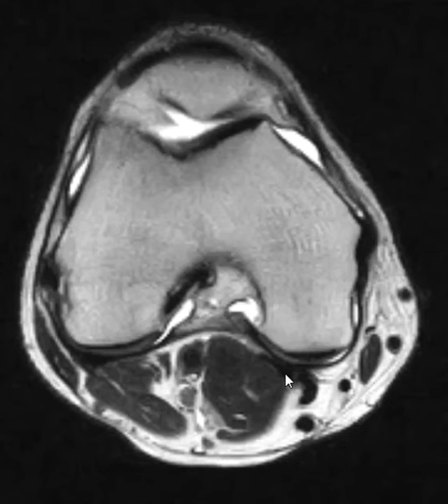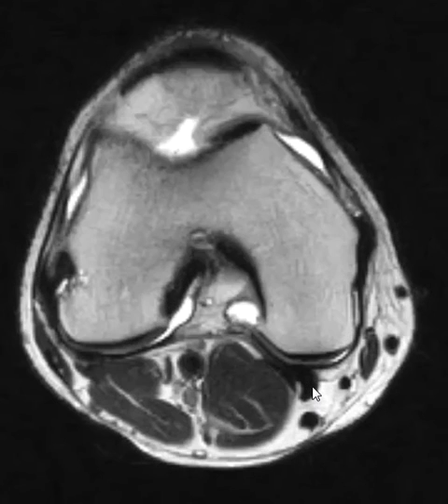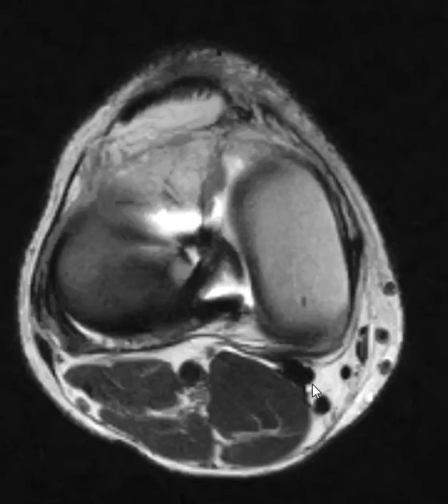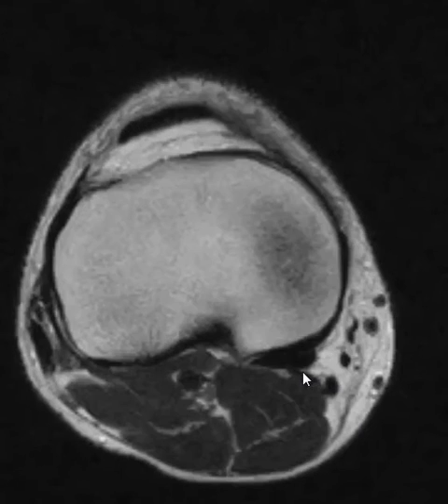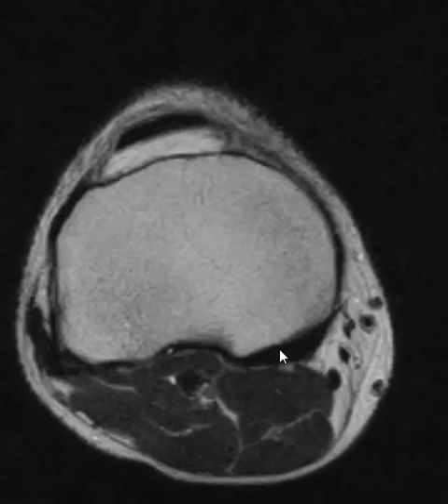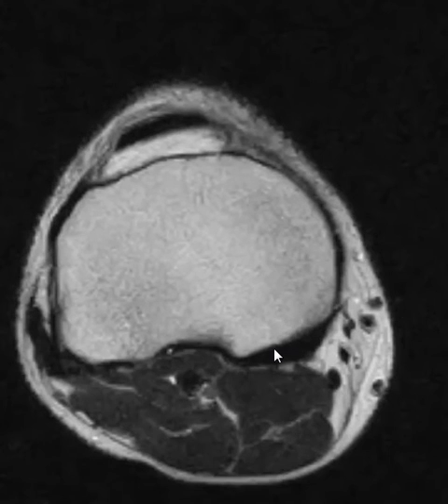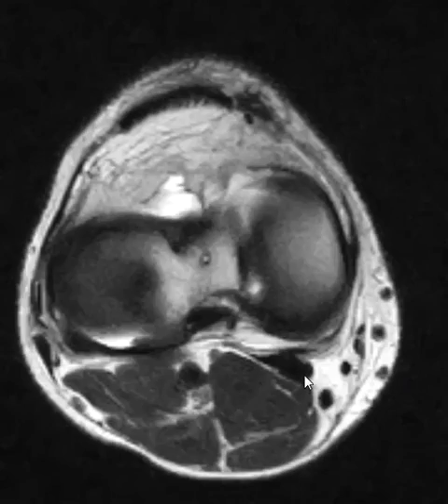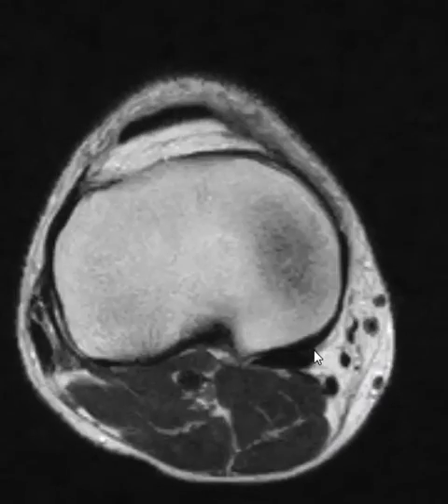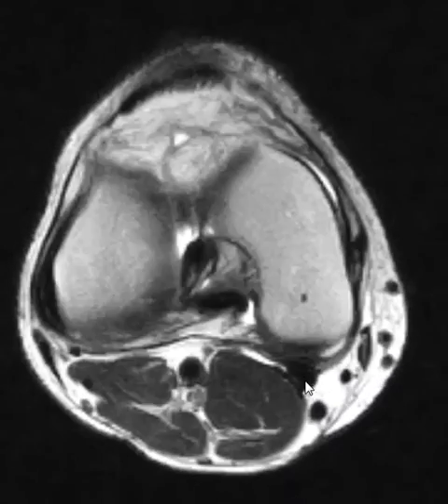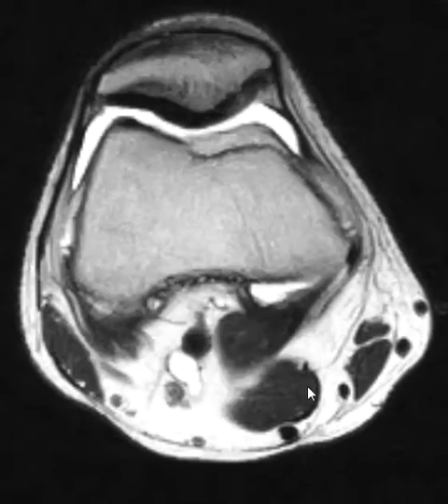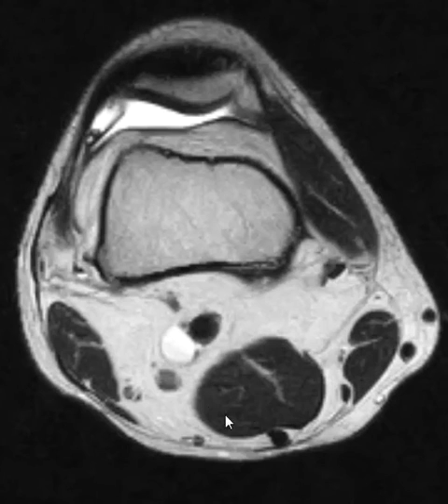Here are the semimembranosis and the gastrocnemius, and there's that bursa where you see popliteal cysts. As the semimembranosis goes down, it broadens out right here and attaches to the posterior medial tibia — very broad. This is where the joint capsule and the semimembranosis come together. Following back up, we can see the semimembranosis muscle belly.